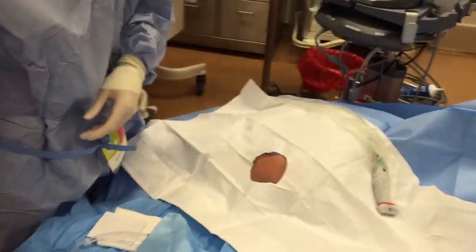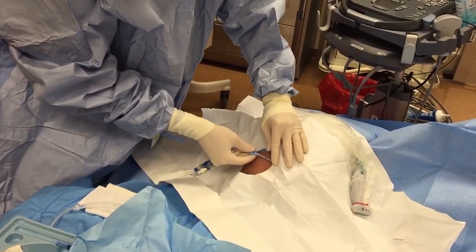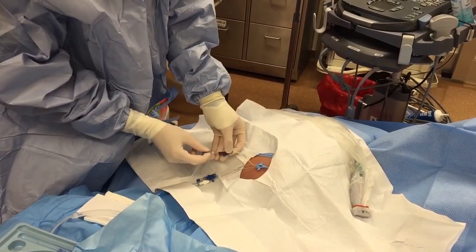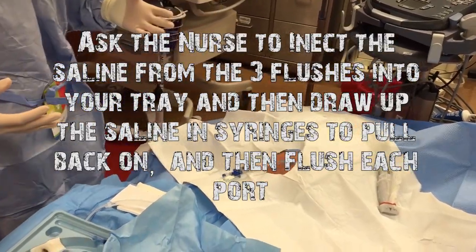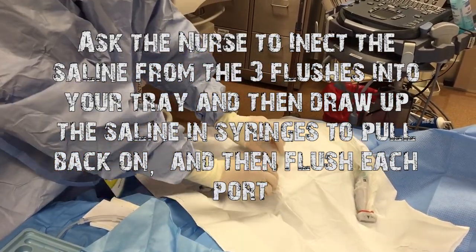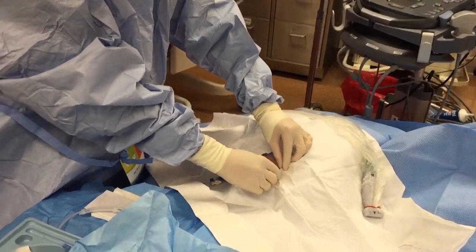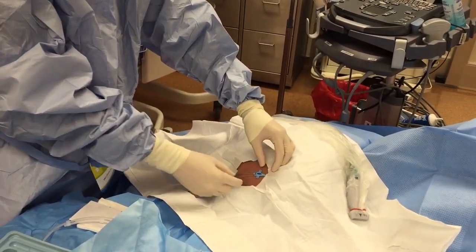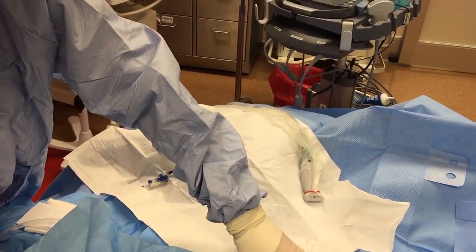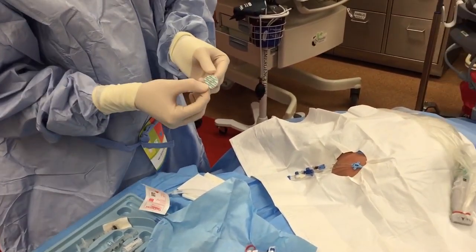We're not going to talk about doing the line at this point — we're going to move on to the line already being in. We've already flushed all the ports, or we'll save the flushing until after we get all these drapes off — either way is okay. Most of our lines here are 15 centimeters, so they're going to be all the way in at the skin, and there won't be anything emerging except for these little ears, which are going to get sewn in. Then you're going to reach into the place that your gown came from, and in there should be a biopatch.